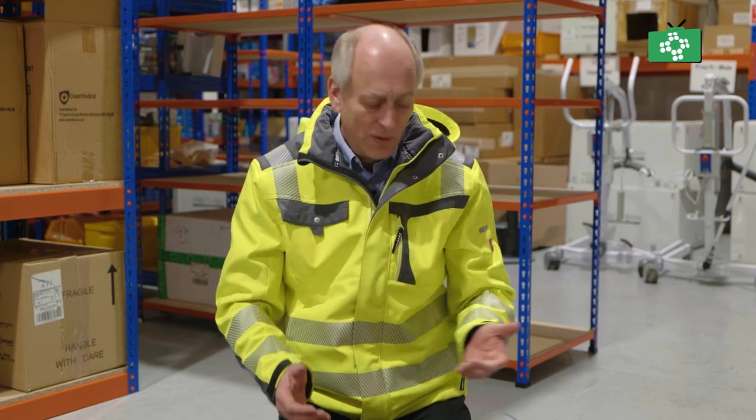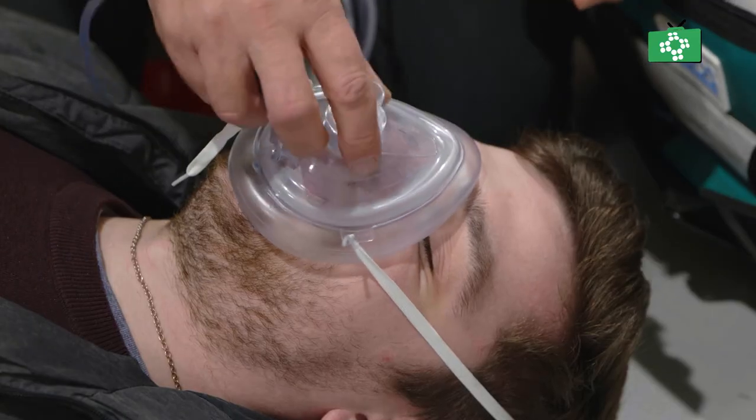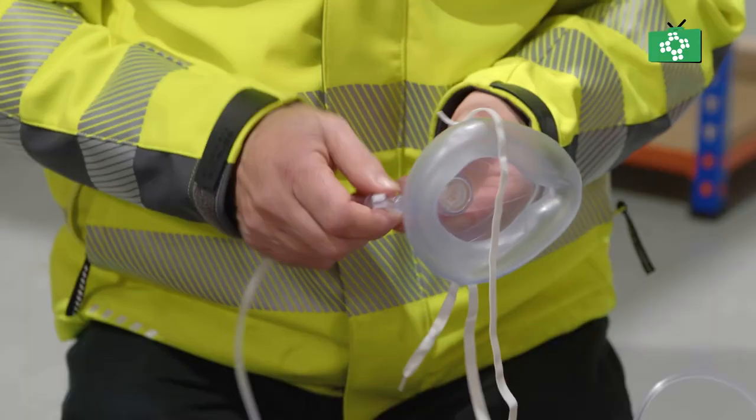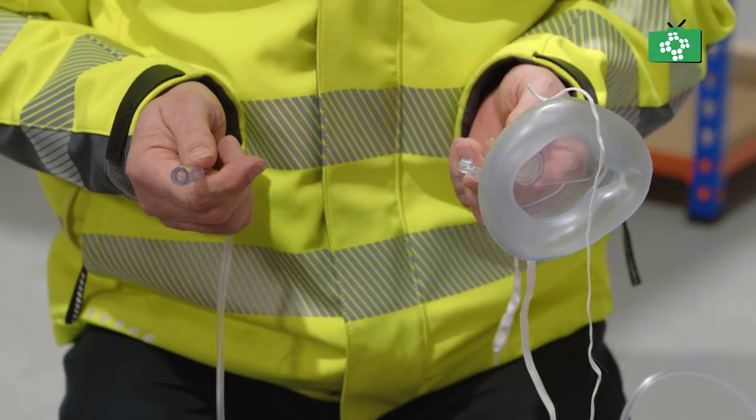By using supplementary oxygen with the pocket mask, you can quite easily get a high percentage of oxygen going in with every single breath. Once you've finished, all you need to do is turn the tank fully off, then you can remove this and take it to bits. Once you've used it, you'll need to throw that away and also throw the oxygen tubing away because it's all single use.